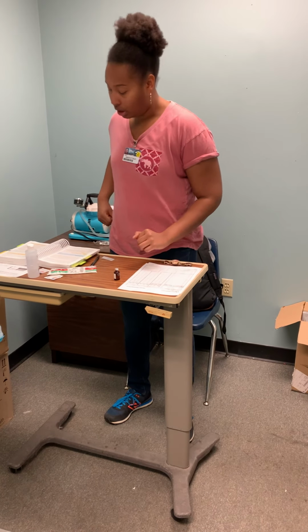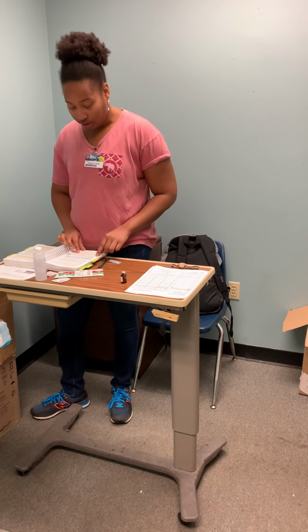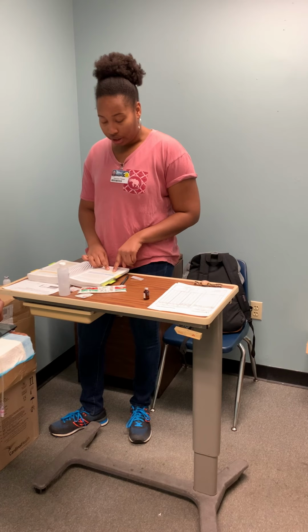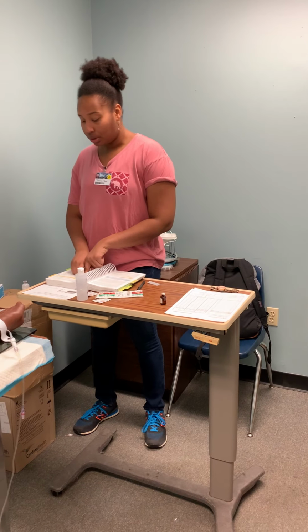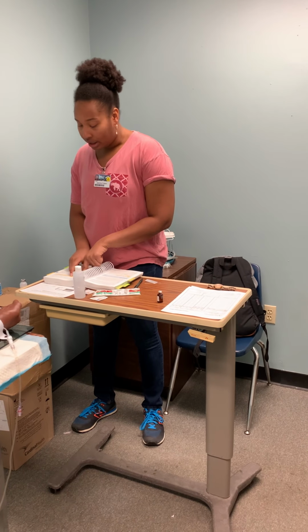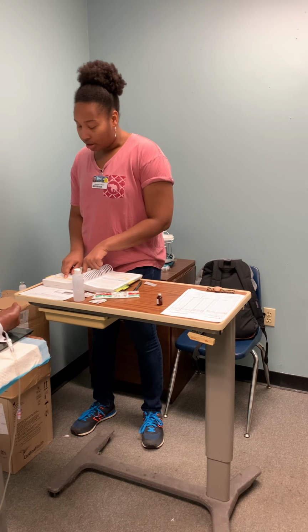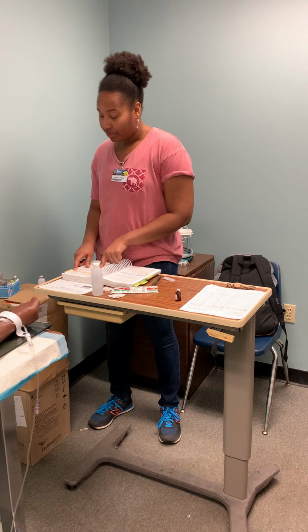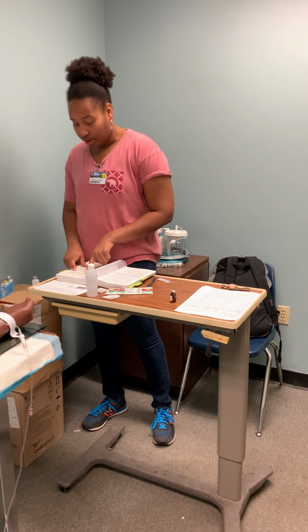Next, I will come to my book and make sure this is a safe dose. It says that I can give 20 to 40 milligrams and it may be repeated over 2 hours. Next, I will be checking for the dilution, and it may be given undiluted. It's not usually added to IV solution, but large doses may be added to normal saline, lactated Ringer's, D5W, and given as an infusion.